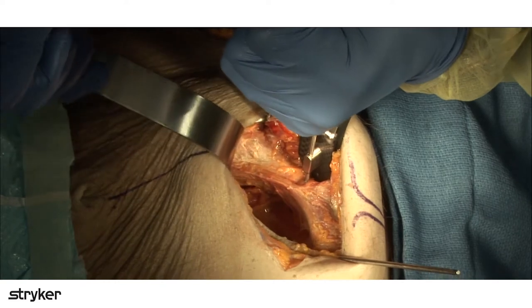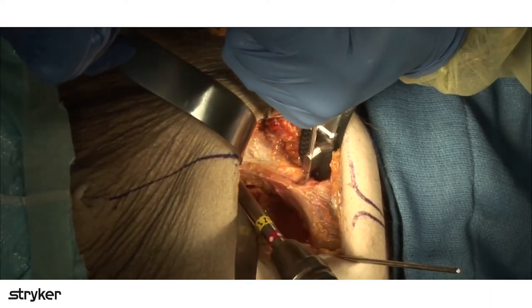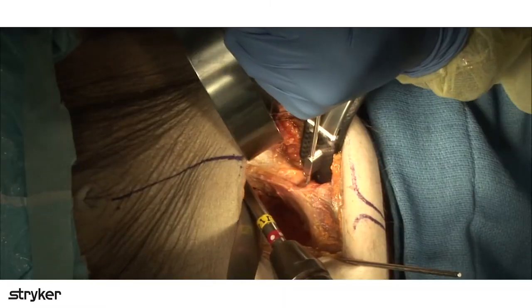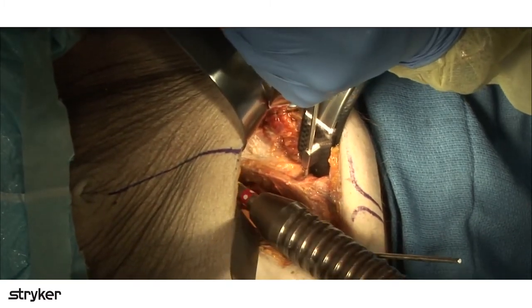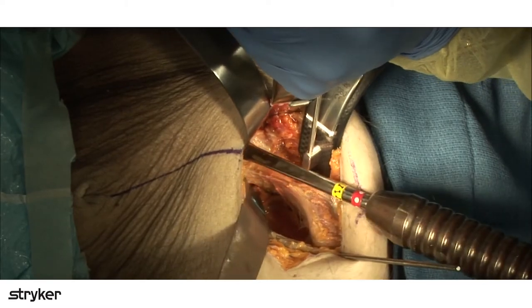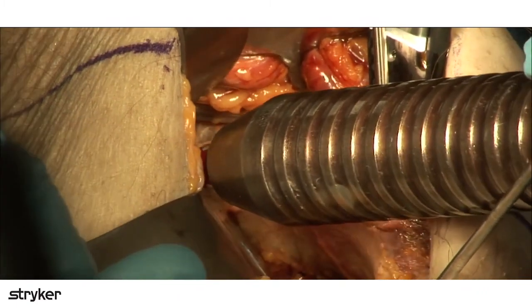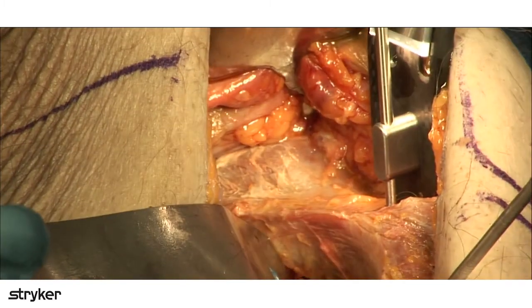So we're going to come up this way. All right, now we're going to come in underneath this. That's all iliacus. Oh, what happened? There we go. All right. And so what we're going to do now is take the cob, and we're just going to slide it up the internal iliac fossa. And this is going right lateral to the sacroiliac joint.